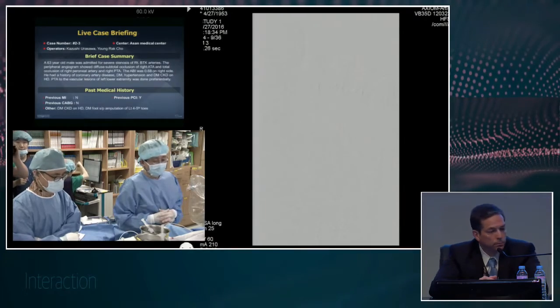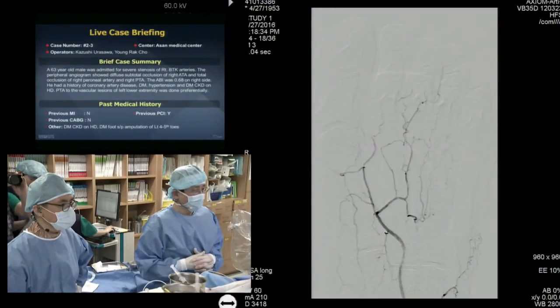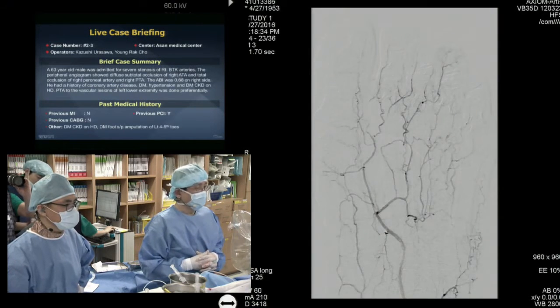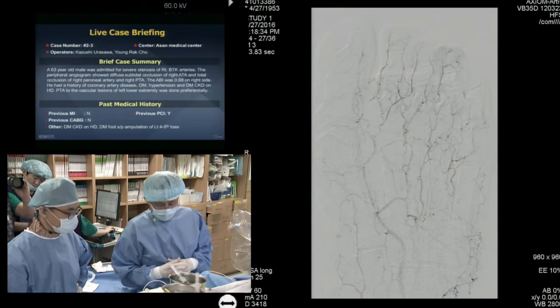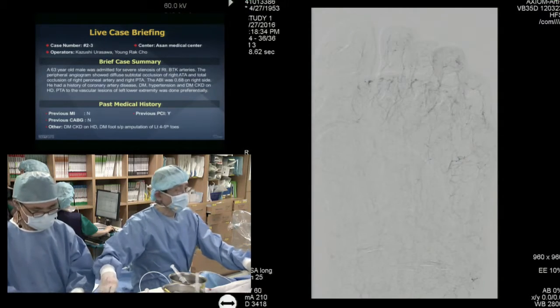Yeah, I'd like to try a 2 millimeter balloon for distal again, maybe 2 or 3 minutes, long inflation. And I think that's fixed the problem, I guess. Yep, let's try. 2 millimeter balloon again for distal.